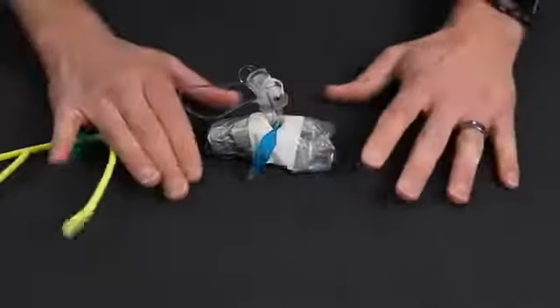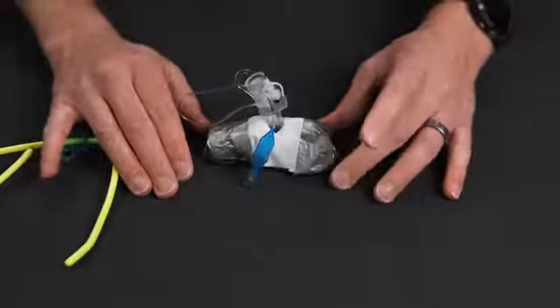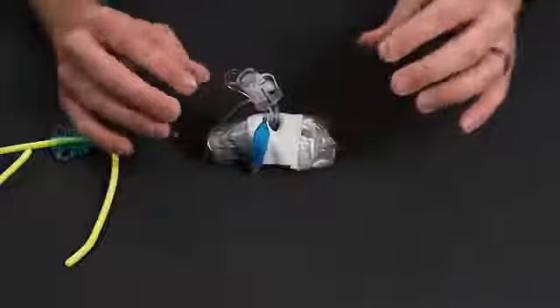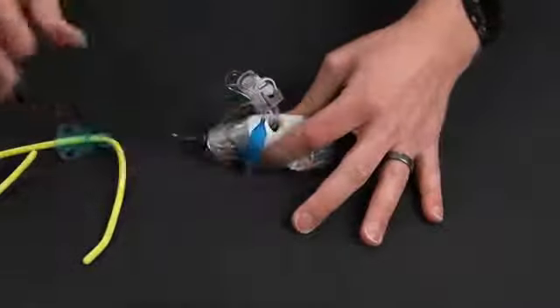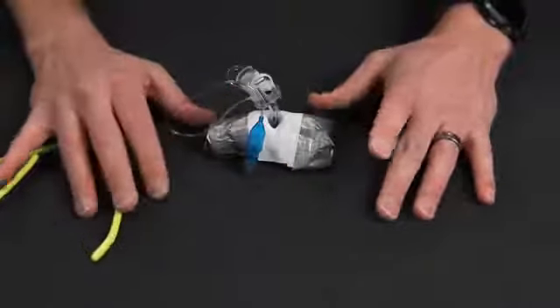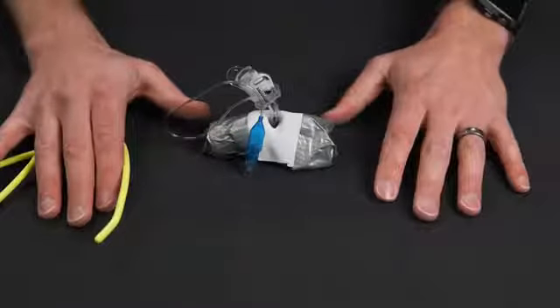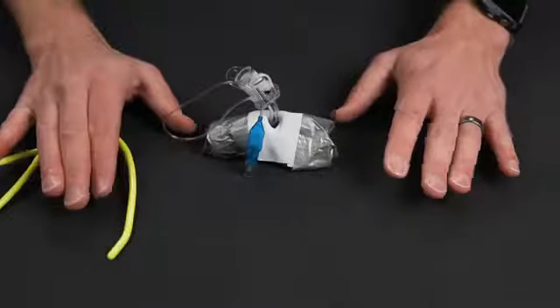One complication you may see with this that indicates a failed attempt at a cricothyrotomy is what's called a false lumen. So if we didn't do a good job at place holding that orifice we created, or if we missed and we didn't know it, then there's a chance that this gets inserted between the skin and the trachea, and as we start bagging them, it will cause a lot of subcutaneous emphysema, which is basically air bubbles under the skin. It can also cause some very serious complications like pneumomediastinum, and most of all, you are not ventilating the lungs in this case. So preventing that false lumen and confirming it's in the right place are of the utmost importance.